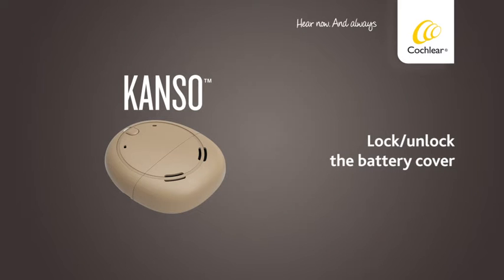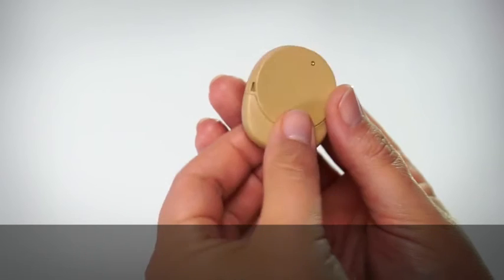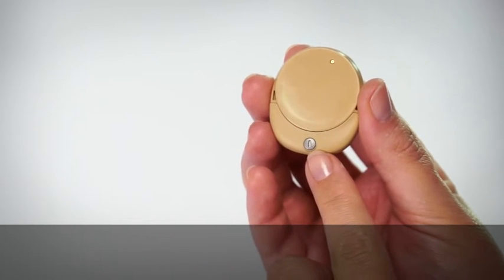Lock and unlock the battery cover. The battery cover has a tamper-resistant lock to help prevent children from opening the battery cover.